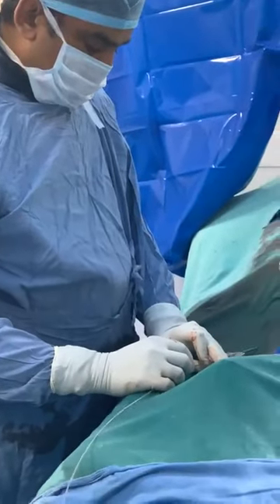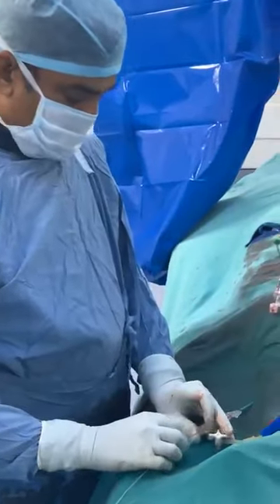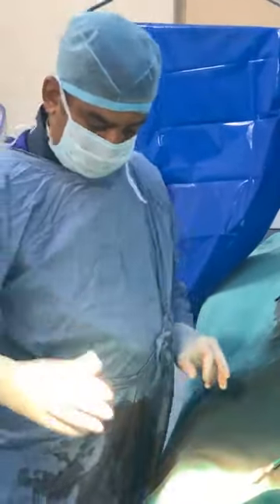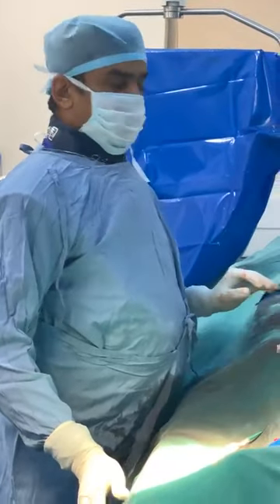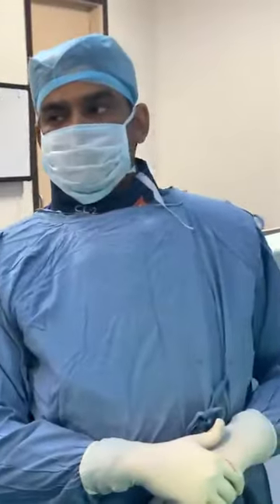Like this. We allow the fluid to pass. Heparin units, yes. Can you give 1000 heparin units?